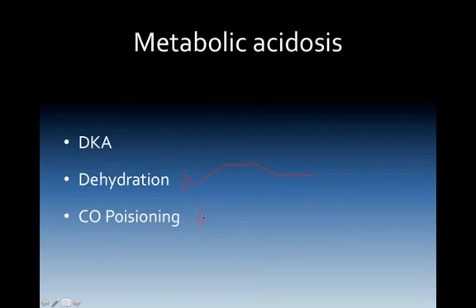Differential diagnosis for a person that might possibly have CO poisoning should be done with a machine that can facilitate if you have carbon monoxide present. This differentiation and the values should be taken into consideration for oxygenating your patient. The example of this, if the CO is 24% and the pulse ox says 100% and your end-tidal CO2 is low, there's a good chance that they're in a hypoventilatory state at the cellular level. Load them with some more oxygen, see if we can increase that end-tidal CO2 number.